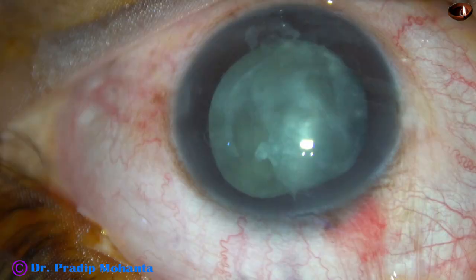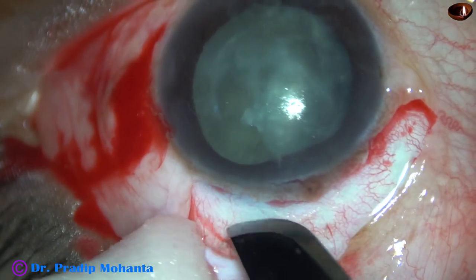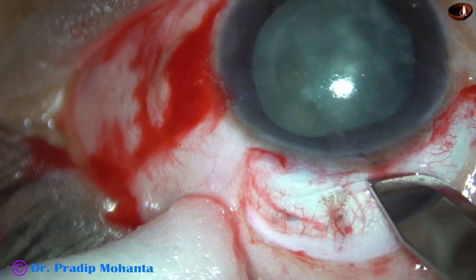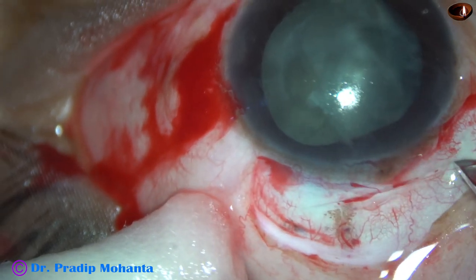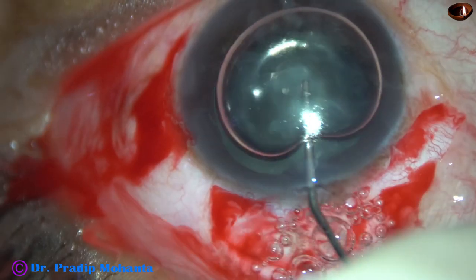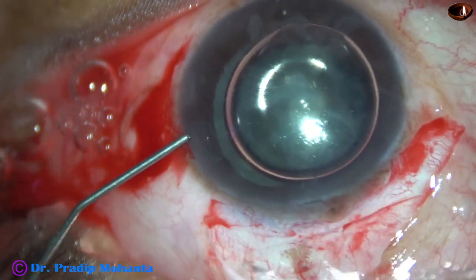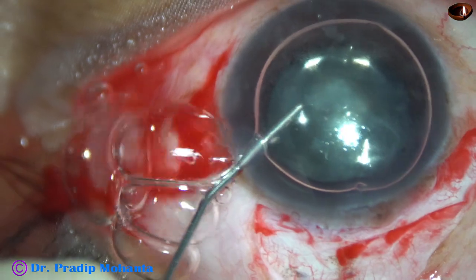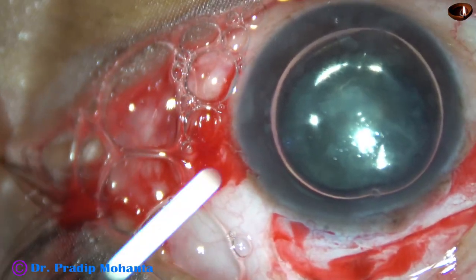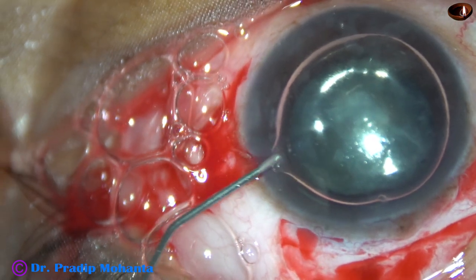This is a case of sinking nucleus. This case was being done by my colleague. After rhexis, he did hydrodissection. And then as he tried nuclear rotation, he found the nucleus to be sinking. And he referred the case to me. So I have taken up this case the next day.